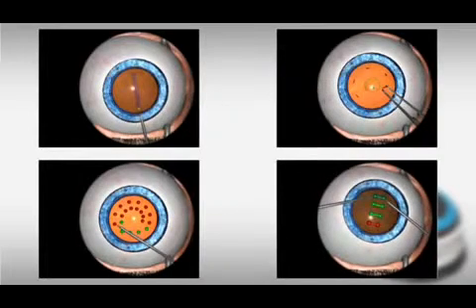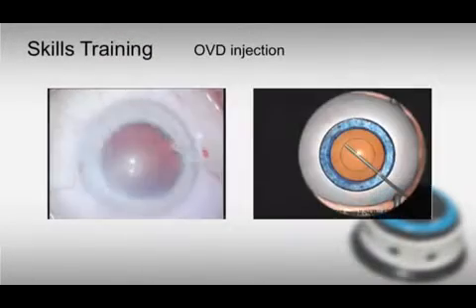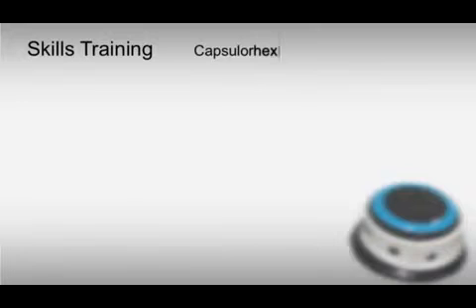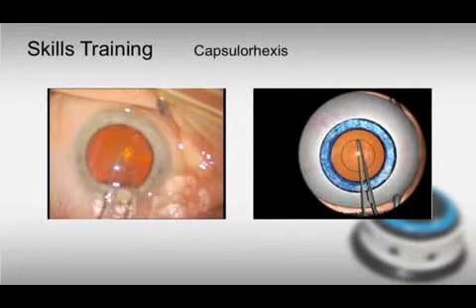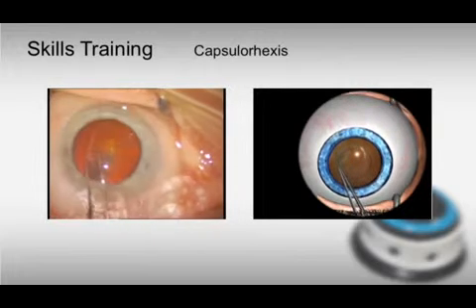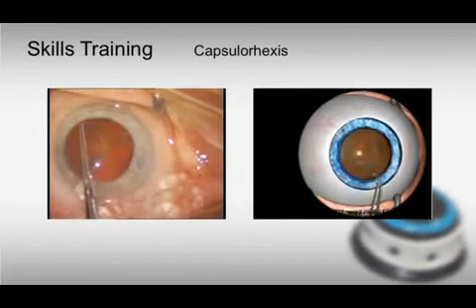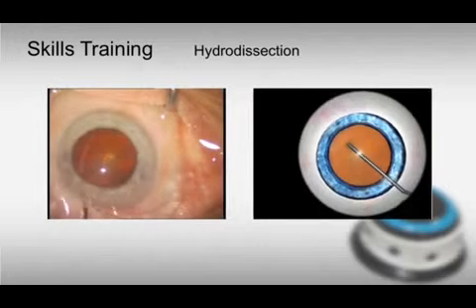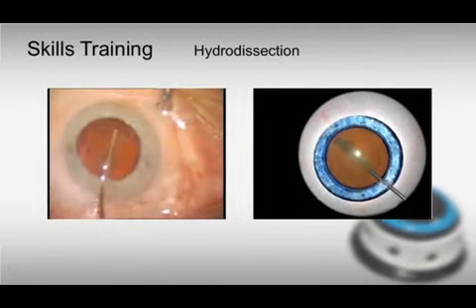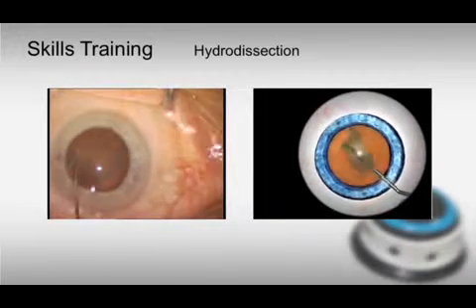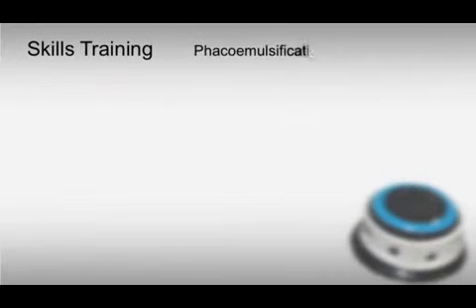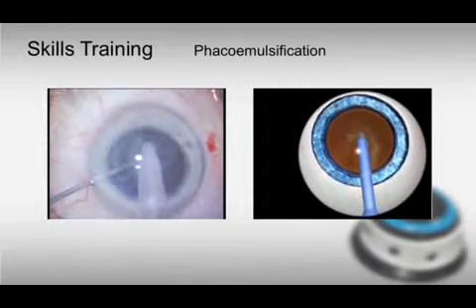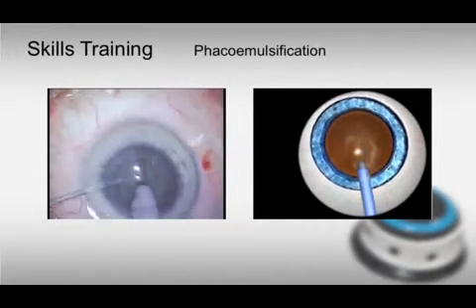Afterward, different steps of a cataract surgery can be performed. First, OVD injection. Capsulorhexis — please compare the real situation versus the virtual simulation. Hydrodissection including rotation of the nucleus. Finally, phacoemulsification including the divide and conquer technique, and quadrant removal.